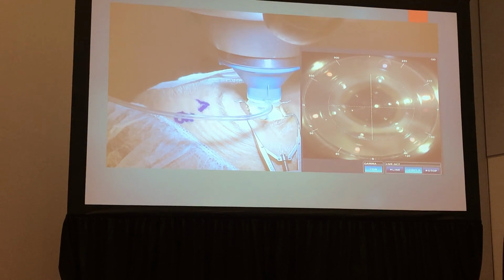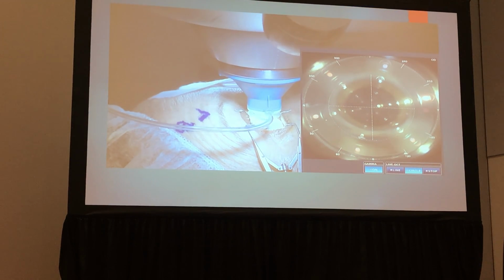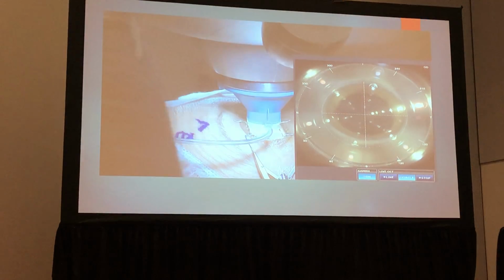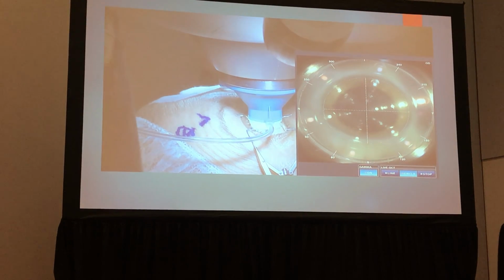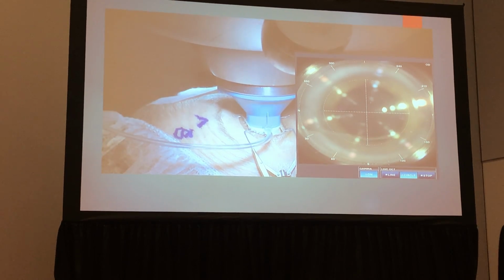Perfect. Under those arcs, because this is registration. So at this point, I know I'm missing the lids there, so I'm going to look now. We'll look up here. She's nice and centered, so we're just going to come on down there. Still watching the lids. She's nicely centered. She's an expert patient here. So we can see the bubbles.